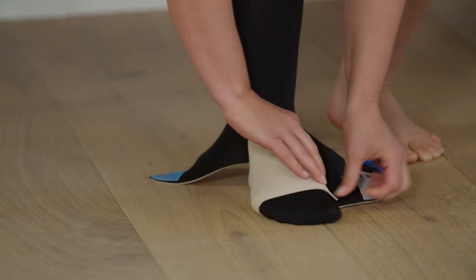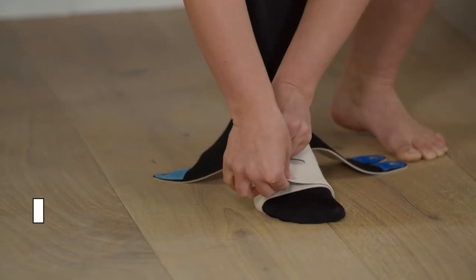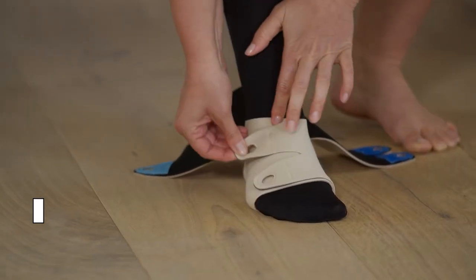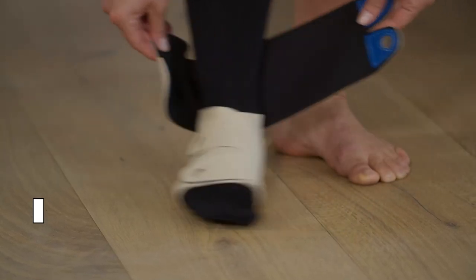Place the strap closest to your toes without the fastener over the top of your foot. While holding that strap down, pull the opposite strap with the two pronged white fastener over the top at full stretch. Fasten it onto the strap below. Adjust the garment for fit and comfort.